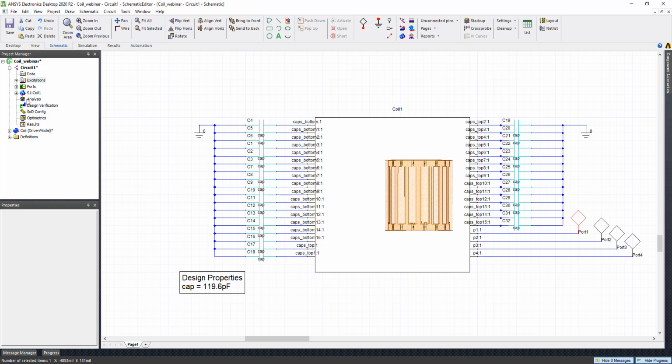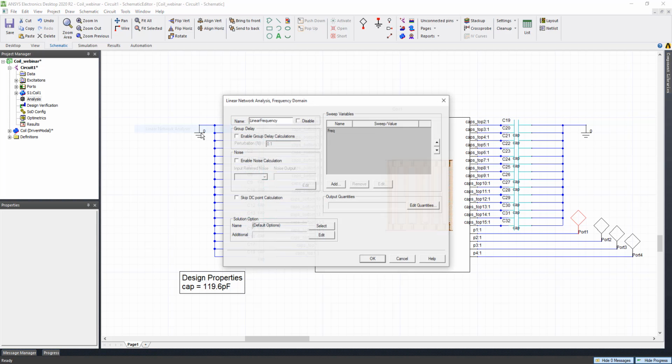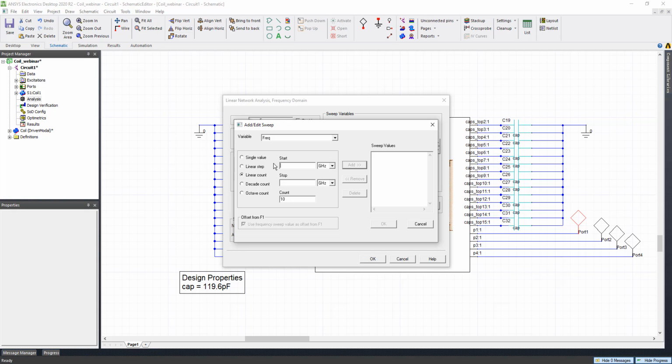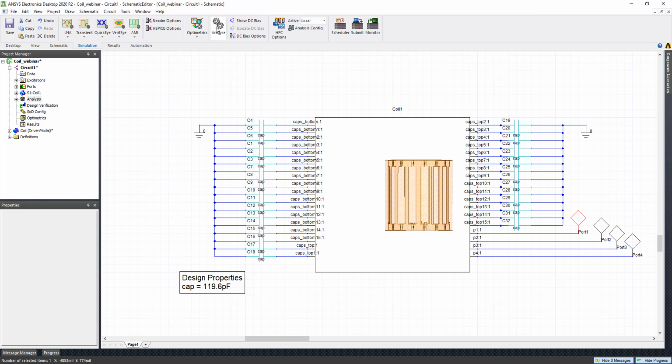So next thing we will need to do is add the analysis setup. I'm just going to add a single point frequency linear network analysis. Add just a single value, 33.8. Okay, looks good. So let's analyze it. Okay, looks like the simulation is finished. It's just that quick, like a snap.